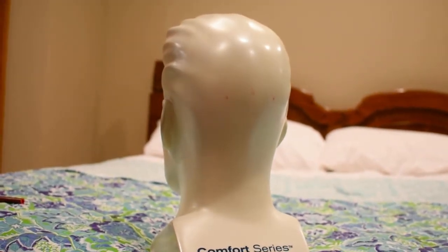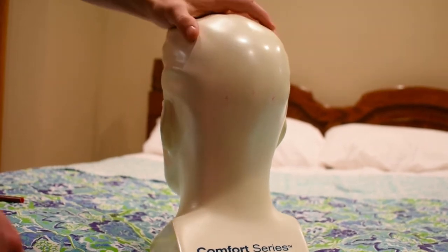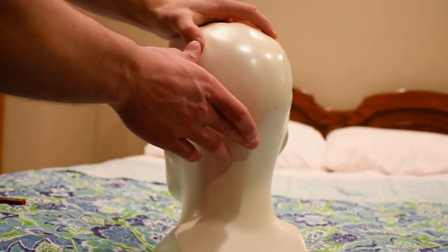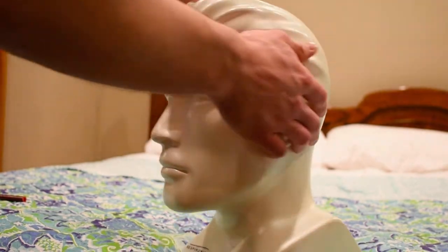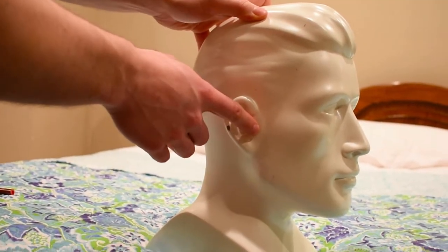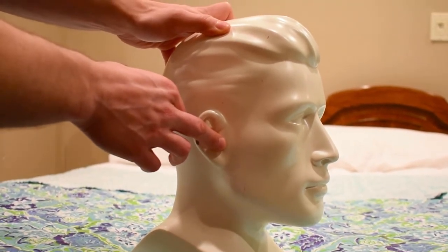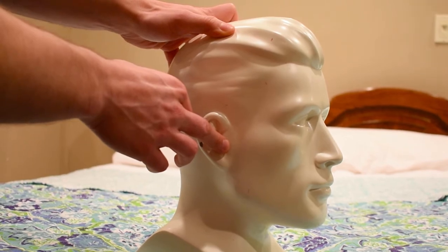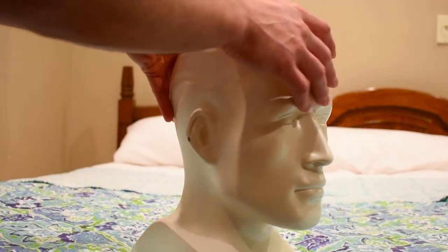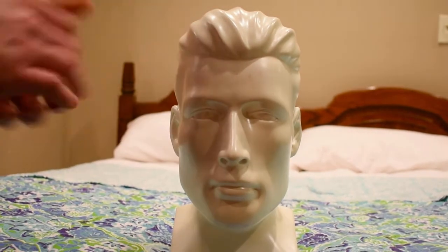It's where the skull kind of protrudes from the head, but you can't really see it real well on this mannequin. And then we have our left and right preauricular sites, which is essentially the notch right in front of the middle of the ear. So once we locate those 4 anatomical landmarks, we are ready to go ahead and begin our measurements.